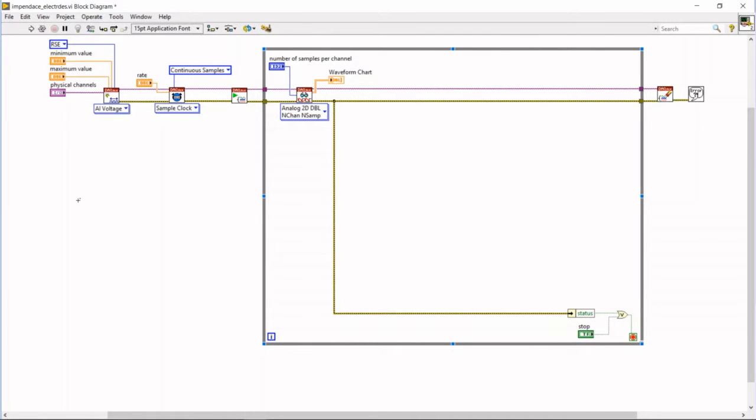We saw the circuit, so I'm going to quickly write the equations we're going to use. So R, that is the real part of our unknown impedance, is equal to R1, the resistance that we know of, times sine of theta, that is the phase difference between V0 and V1, times V0 divided by V1, minus R1, the resistance that we know of. And the unknown imaginary part of our impedance is equal to R1 times sine of theta times V0 divided by V1. Okay, this is cosine. I took a wrong function.